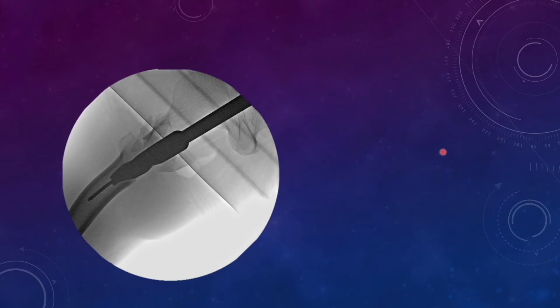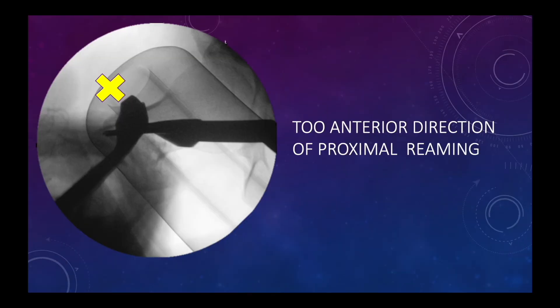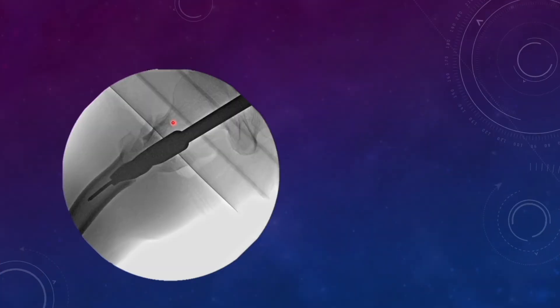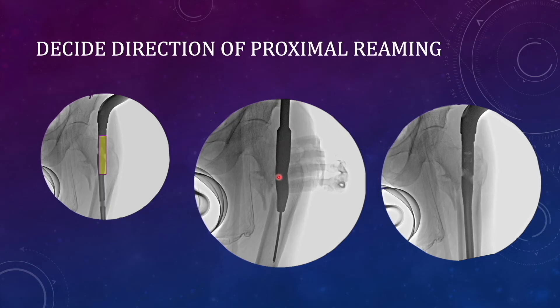Be cautious: whenever you are doing proximal reaming, always check the lateral view, because the proximal fragment has a tendency to deviate from reduction during reaming. Always check both AP and lateral views. Most commonly, the proximal fragment tends to remain in flexion during proximal reaming — so always confirm flexion is corrected before and during proximal reaming. We planned the desired track and performed proximal reaming in that specific direction, which prepared the area for nail insertion, and the nail aligned in that direction to achieve good alignment.